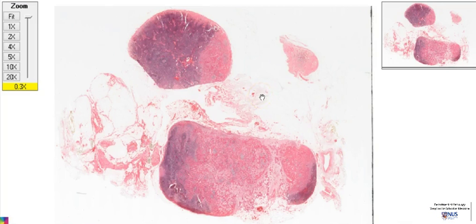So in the context of metastatic squamous cell carcinoma in a lymph node, of course, clinically it would be very important to know where the source is. Perhaps this could be from a laryngeal squamous cell carcinoma, perhaps from a skin squamous cell carcinoma. So clinically, the location of the lymph node would be in the draining region of that particular primary carcinoma. And of course, when we look at the staging, the TNM staging, this would at least be N1 already. And in fact, it's maybe potentially even higher because there's 1, 2, 3 lymph nodes that are involved.